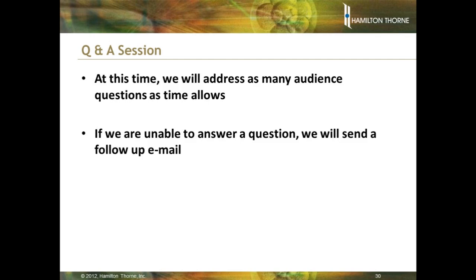Great. What percentage protein do you recommend for micromanipulation? I use the standard protein concentration for embryo culture across the board for micromanipulation, same as for culture. Great. Which in my case is 10% volume to volume using a serum substitute.